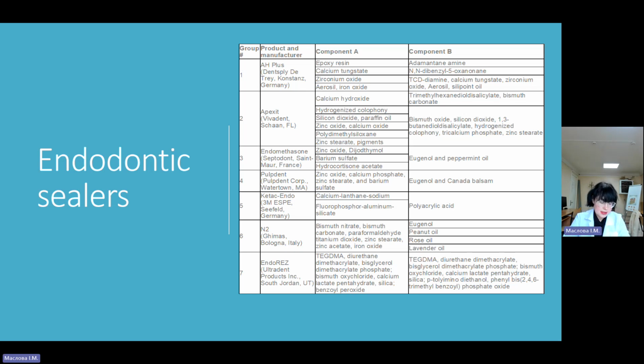Following its success in the treatment of open apices, mineral trioxide aggregate may now be used as a root filling material on its own in selected cases. In addition, MTA and related hydraulic calcium silicate cements have an increasing role as root canal sealers. Despite these developments, some root canal shapes, especially oval ones, remain challenging to fill.